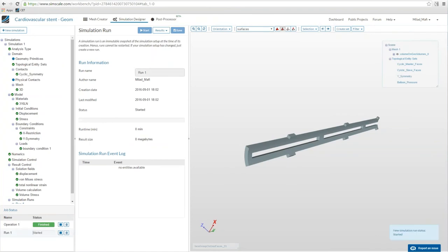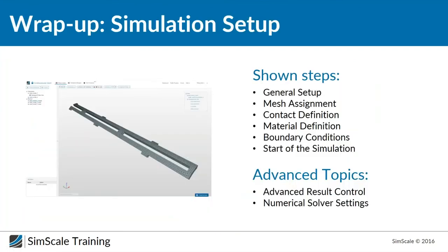Our simulation will be calculated in the cloud and we will get a notification when finished. To recap: we discussed the general simulation setup — static analysis with advanced non-linearity, how to assign the mesh and create topological entity sets to reduce work for boundary condition setup, the cyclic symmetry contact, defining the plastic material using the stress-strain table, and setting boundary conditions and numerical parameters. There are also advanced topics like additional result fields and modifying numerical settings for better, quicker results — but for the first step this is great.